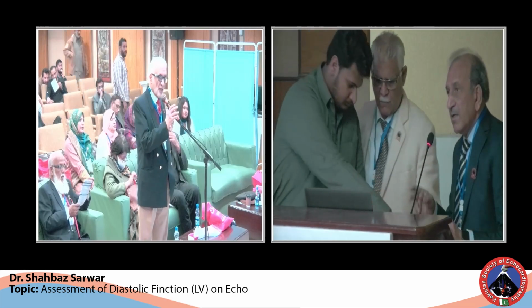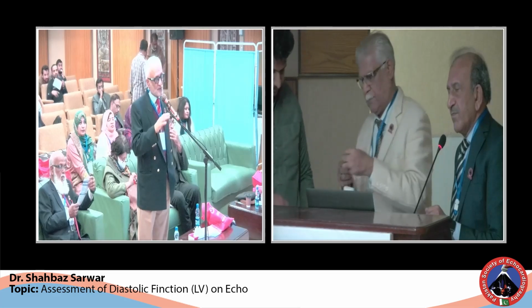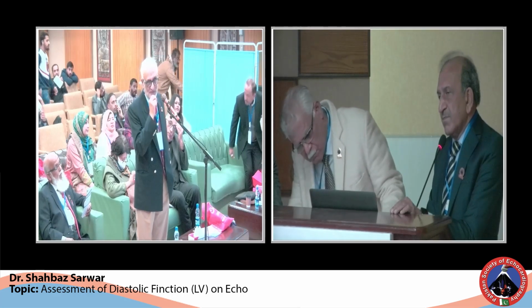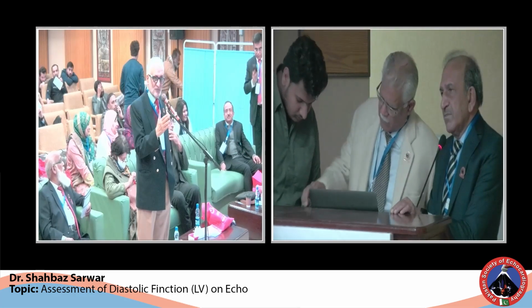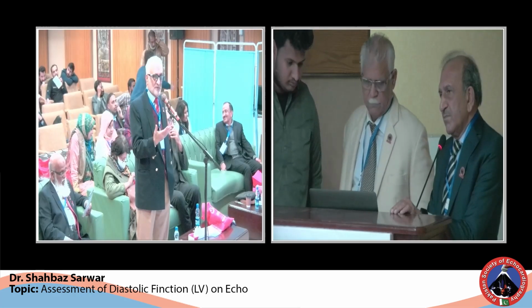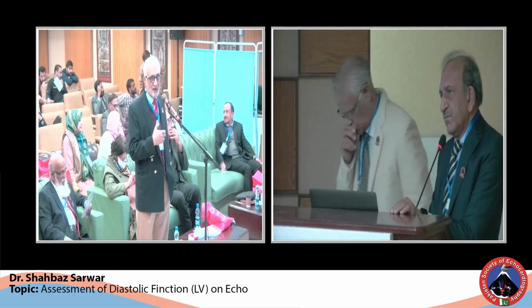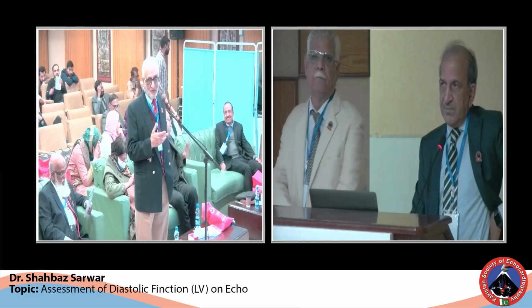Thank you, Shahbaz, for an excellent presentation where you covered most of the things in diastolic dysfunction. Coming to your last slide, I'll just take a cue from there. Sometimes, for the sake of the juniors here, when a patient comes to you and says that he or she is getting breathless, and you do an echo, you find a normal ejection fraction, and there is no significant diastolic dysfunction either.